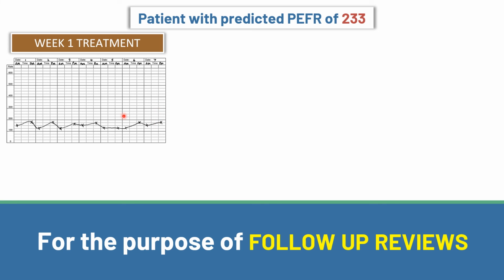So the first thing that you do, you identify the highest and the lowest, because you need that in order to calculate the diurnal variation. But the other thing you need to look at is the baseline, because its predicted is 233. So that predicted, if you ever think about it, is that line. So straight away you can see that the baseline is less than the predicted. So that's something for you to keep your eyes open for.